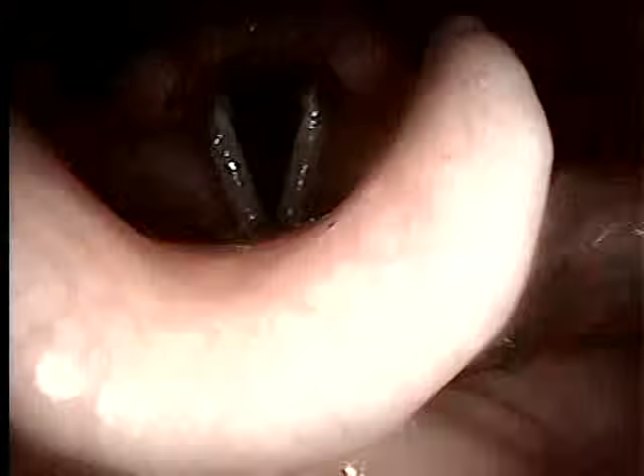Oh, it hurts for some reason all of a sudden. Maybe I was using my nose, tilting it up or something.